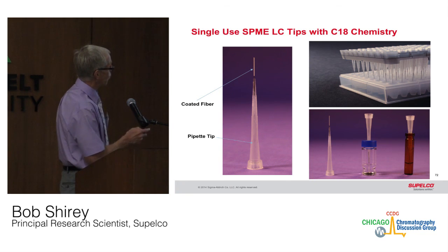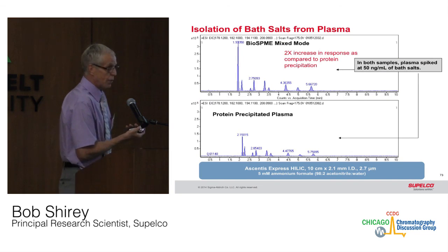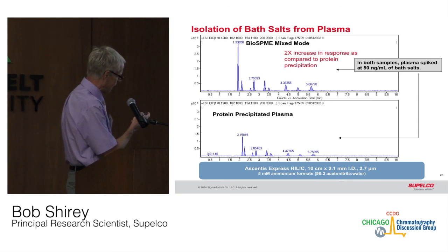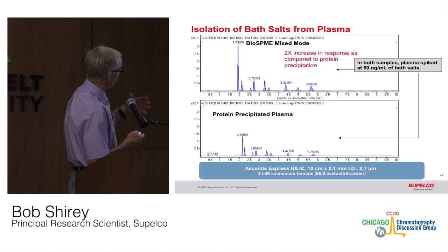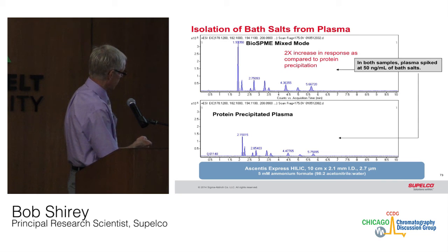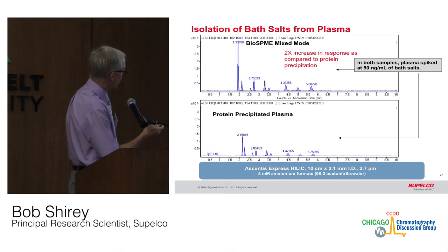And we've looked at this with urine and with plasma. In this case, we're looking at a silica with a mixed mode phase, which is C18 and a strong cation exchange. We're looking at the extraction of amphetamine type compounds or bath salts, synthetic amphetamines. Generally, when they do an analysis, often they just precipitate the protein and make a direct injection into the HPLC. And so we compared that to an SPME extraction. You can see we got about 2 times the increase in response.